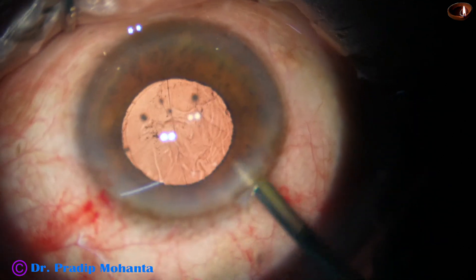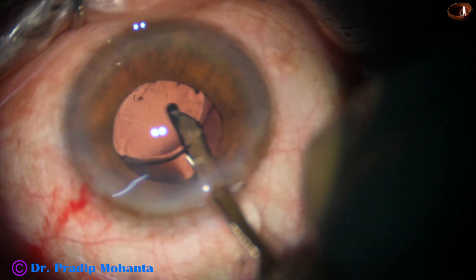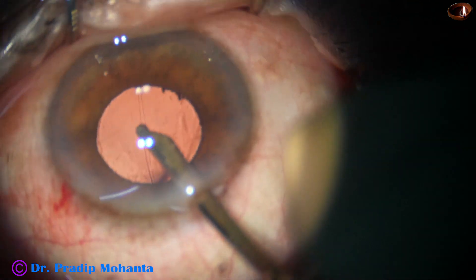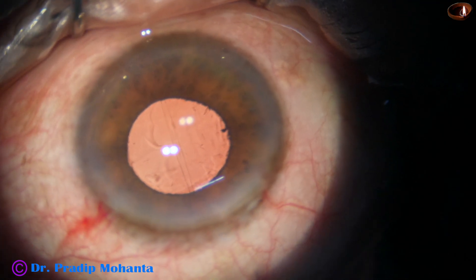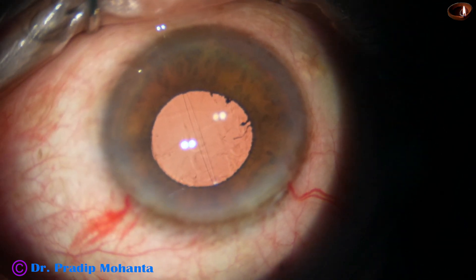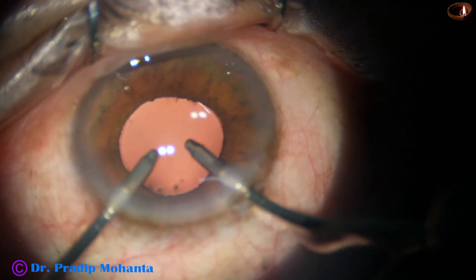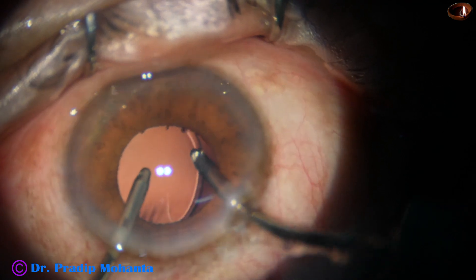Cleanup of the viscoelastic is done. I use the Simcoe first, go behind the IOL, and irrigate and aspirate the capsular bag. Then I do irrigation-aspiration of the anterior chamber in front of the IOL. I then use bimanual irrigation-aspiration, placing the irrigation cannula such that the iris does not prolapse through the main wound.